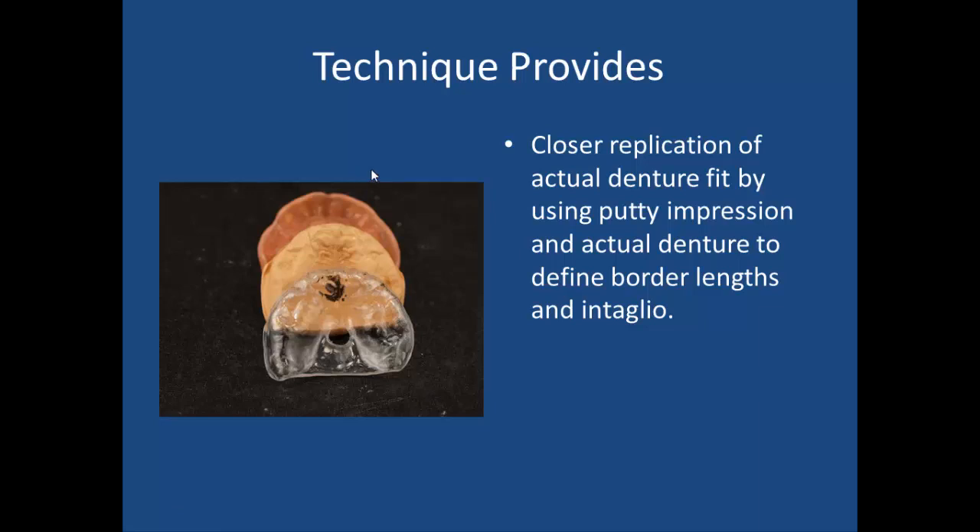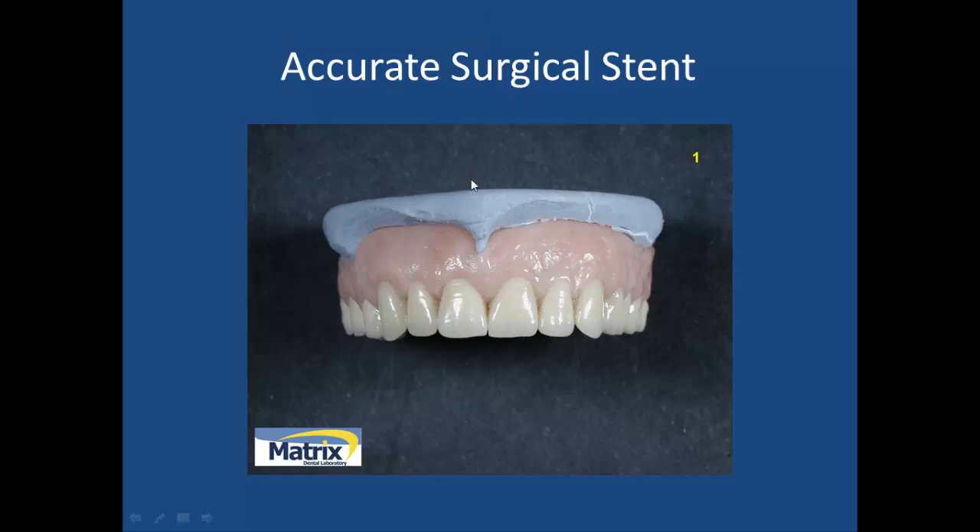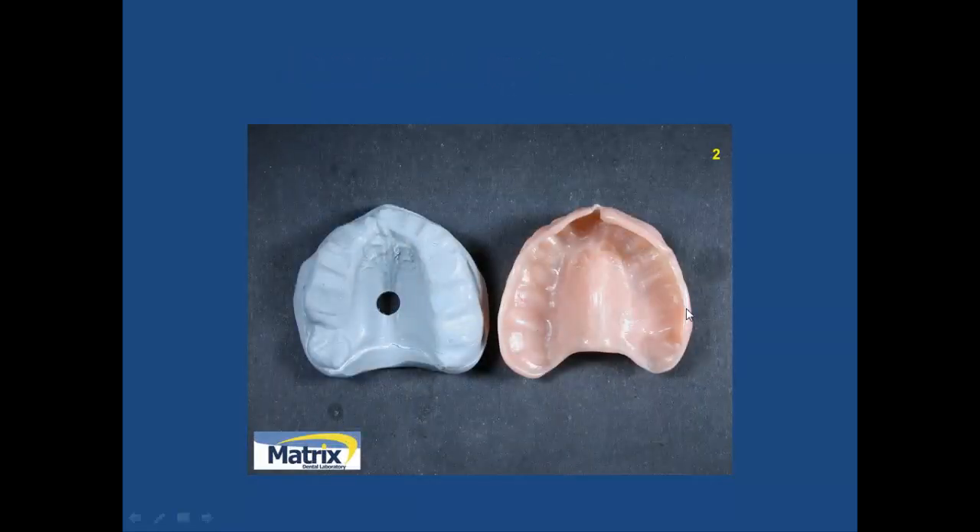This closely replicates the actual denture fit by using a putty impression and the actual denture to define the border lengths and the intaglio. Here's what it looks like when I take the putty and put it inside the denture. Once I've removed it, I'll trim it back because I need to vacuum form over this model and make sure the borders replicate all the way down into the sulcus. I hand pack it in there, making a nice border roll all the way around, and I put a hole in the center so the vacuum forming material adapts as best as possible to the model.